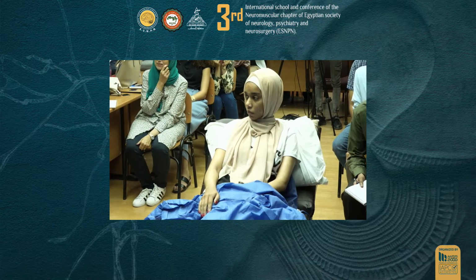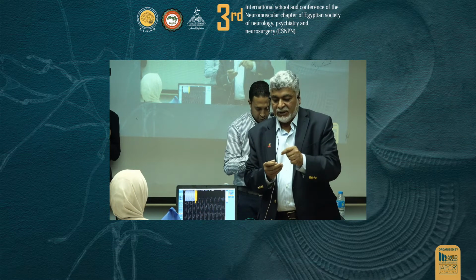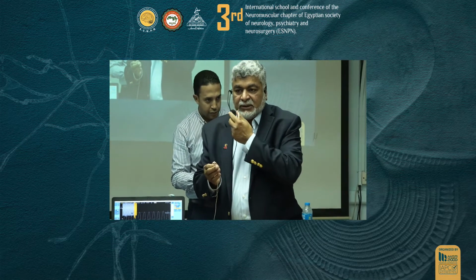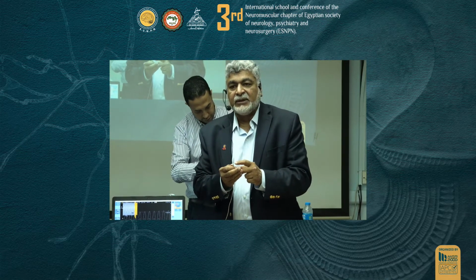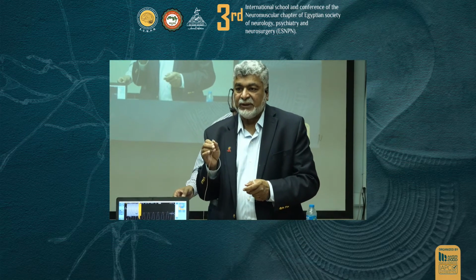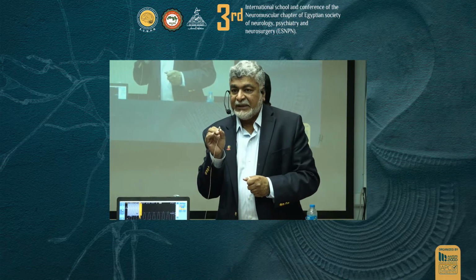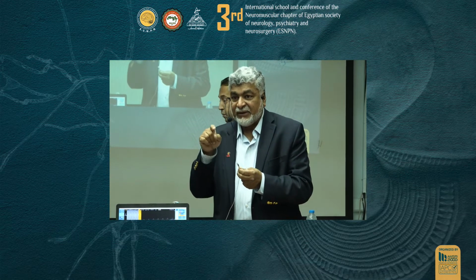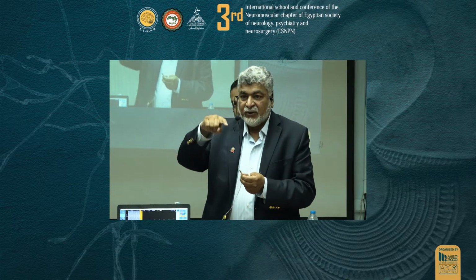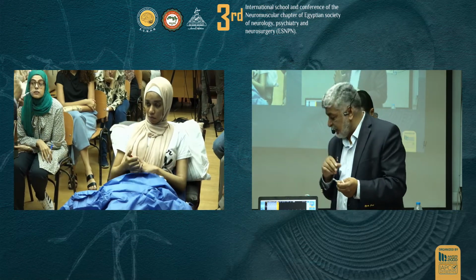It's called concentric because both the recording and reference electrode are in the same needle, as compared to monopolar, where you have to put a reference electrode separately. It's the same principle: the potential is recorded between the recording and the reference electrode. In the concentric needle electrode, both are in the same needle. The shape of the concentric needle area is like a semicircle. It's got a smaller recording area. Monopolar has a large recording area, so the potentials are different. So when you're assessing potentials, it depends on the type of needle too.